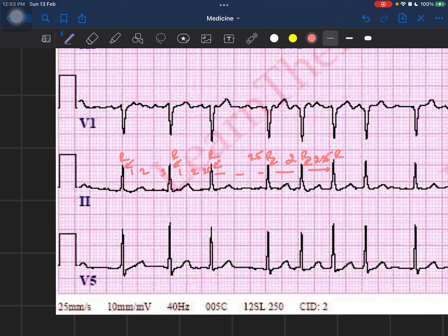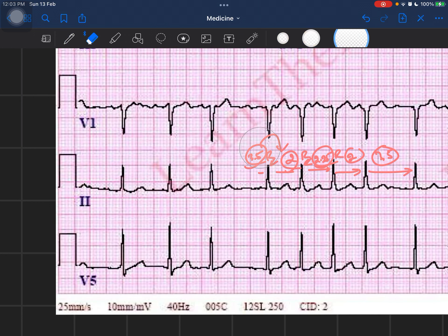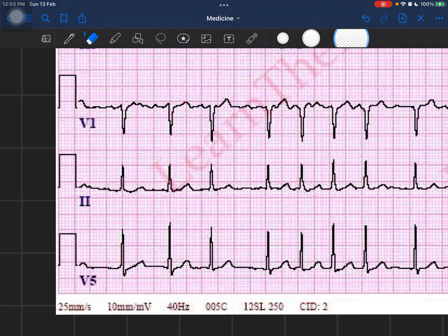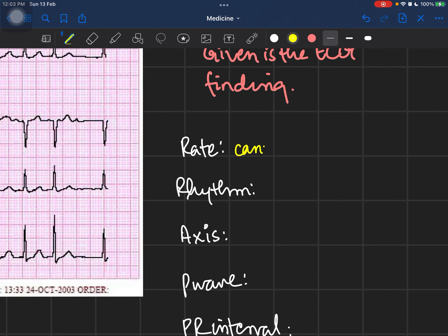Can you predict the irregularity? Is there any pattern? Sometimes there are 3 boxes, sometimes 2.5, sometimes 3.5, then it drops to 2, then 2.25 again — there is no pattern to this irregularity. Therefore this type of rhythm is known as an irregularly irregular rhythm. You cannot calculate heart rate by dividing 300 by the number of large boxes between R waves because that distance is variable — so the rate cannot be estimated.